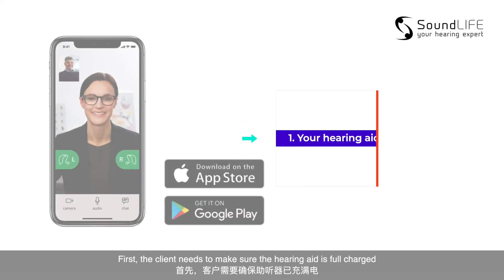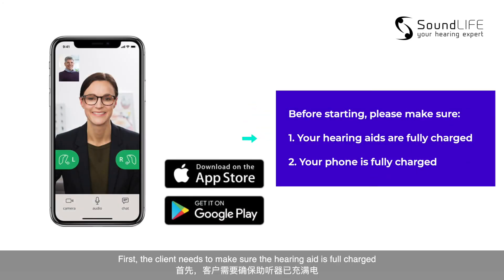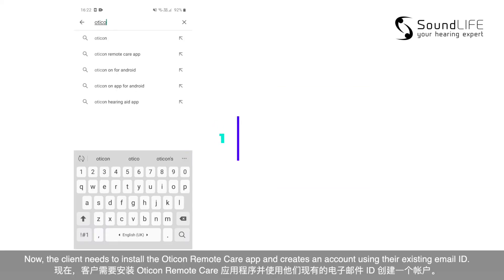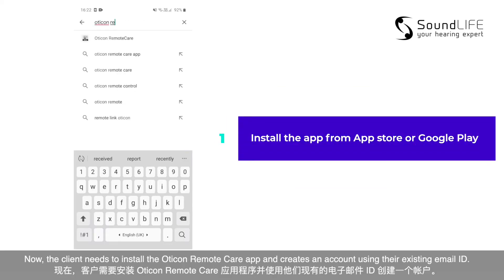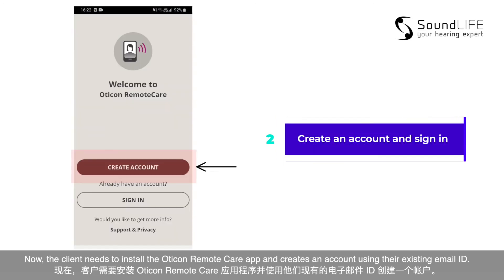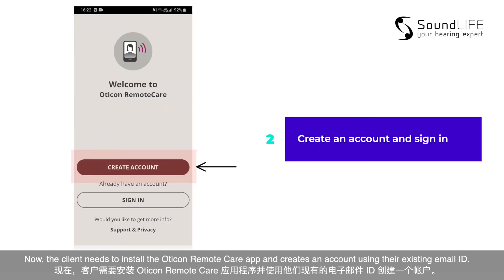First, the client needs to make sure the hearing aids are fully charged and the phone or device used to log in is also fully charged to avoid any disruption in between. The client then needs to install the Oticon Remote Care app and create an account using their existing email ID.